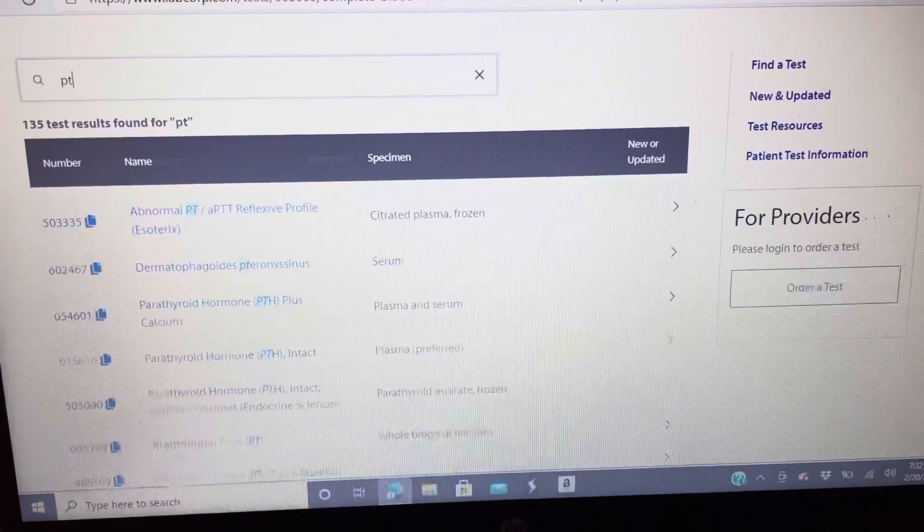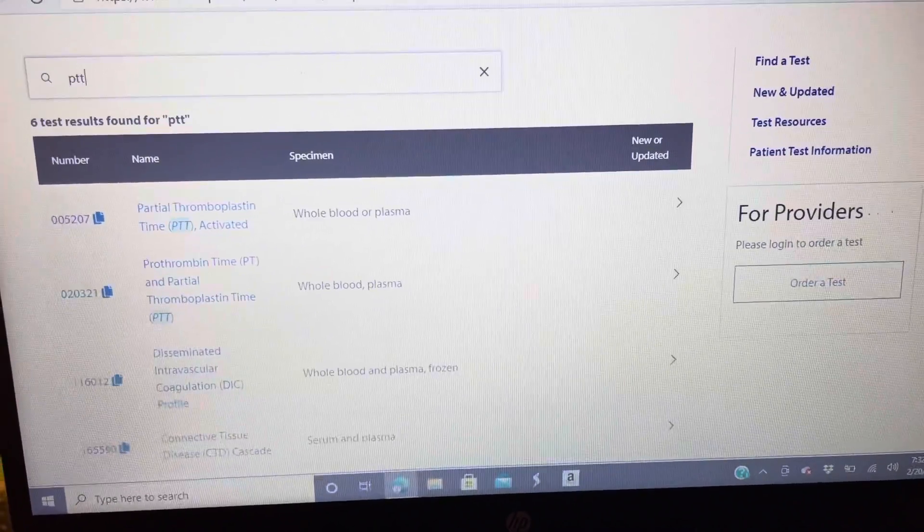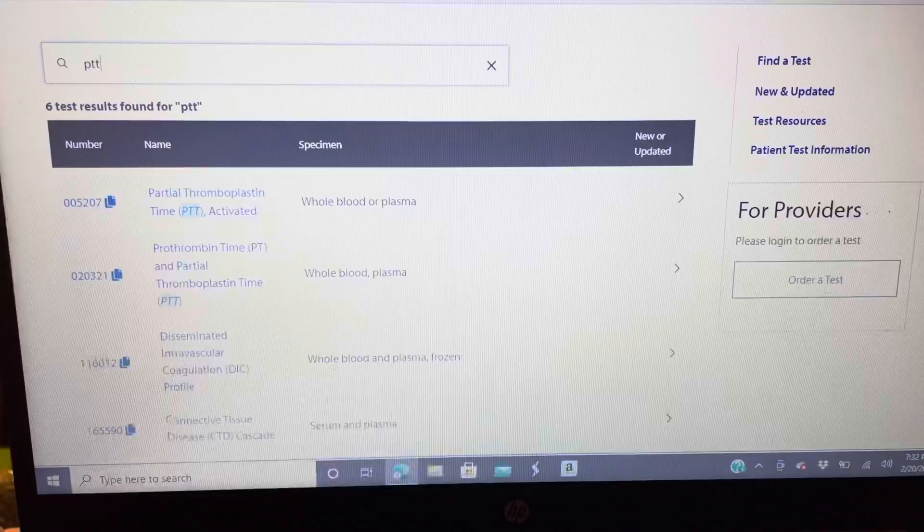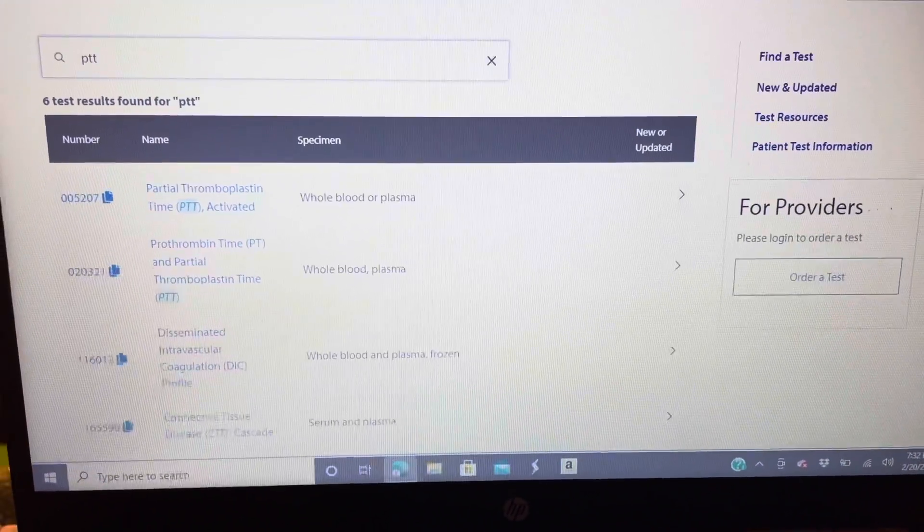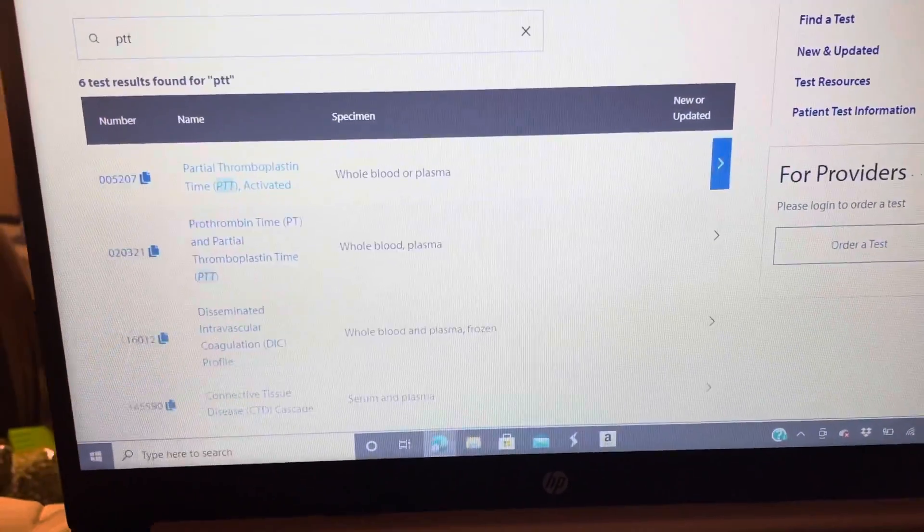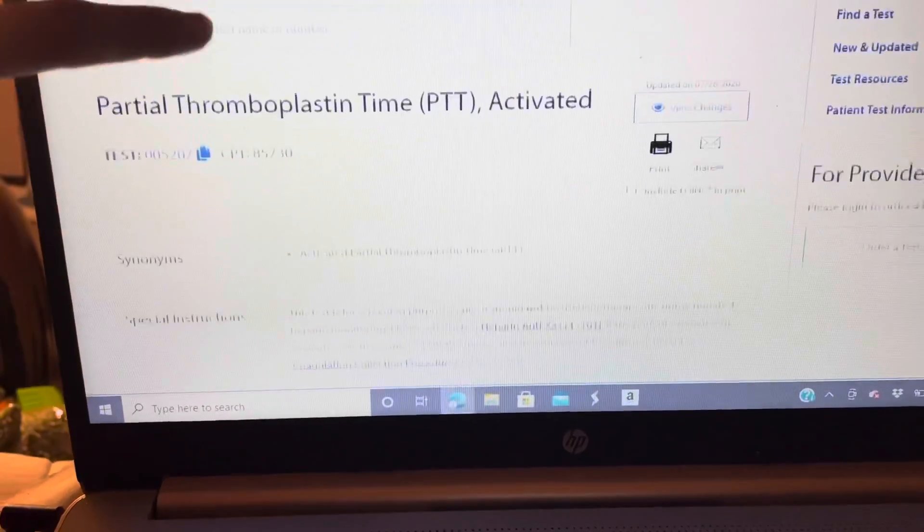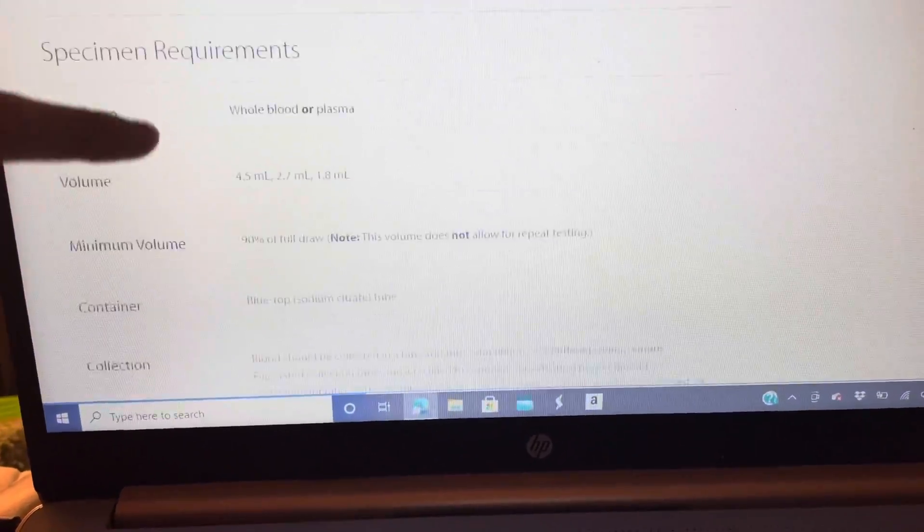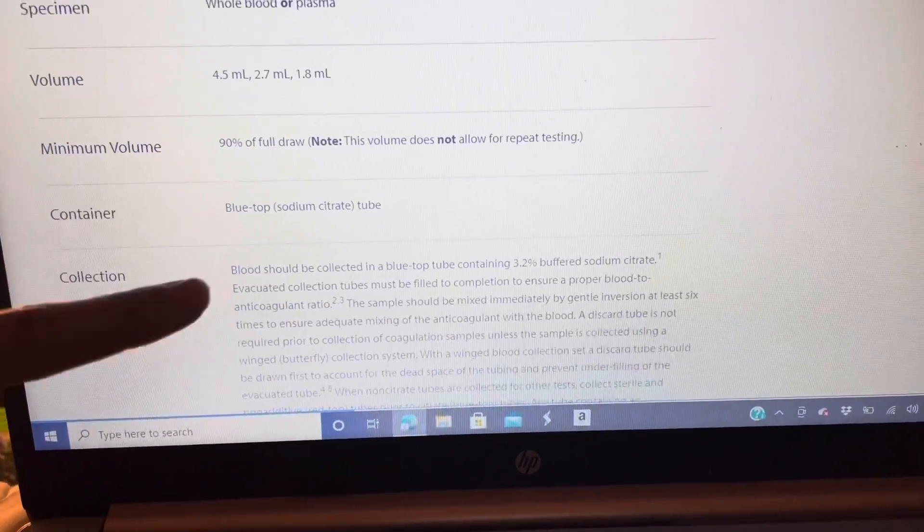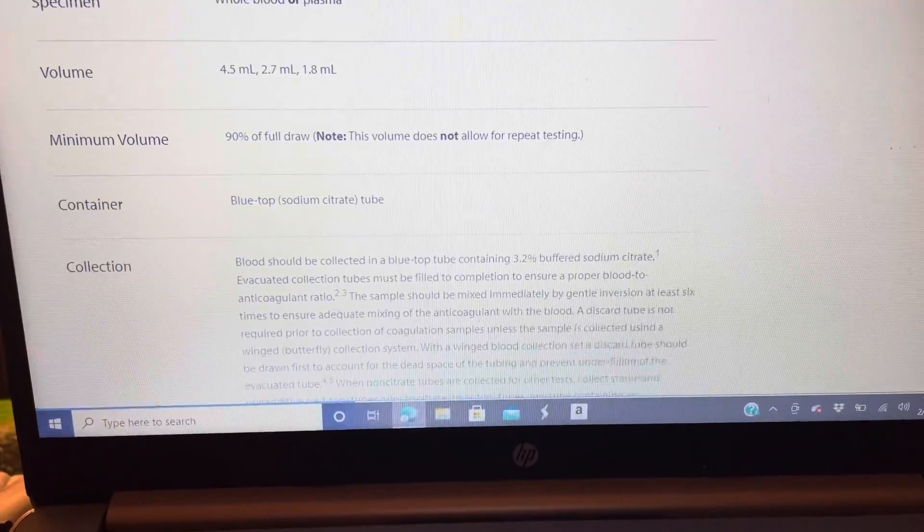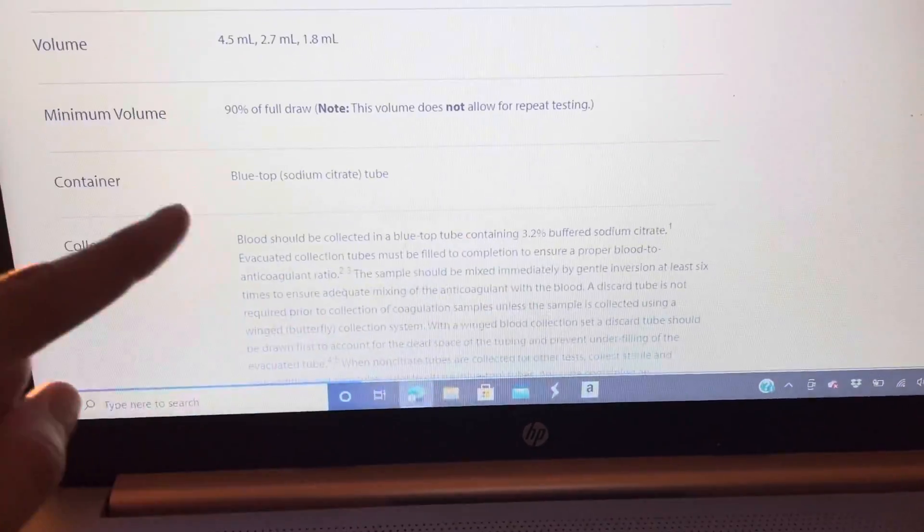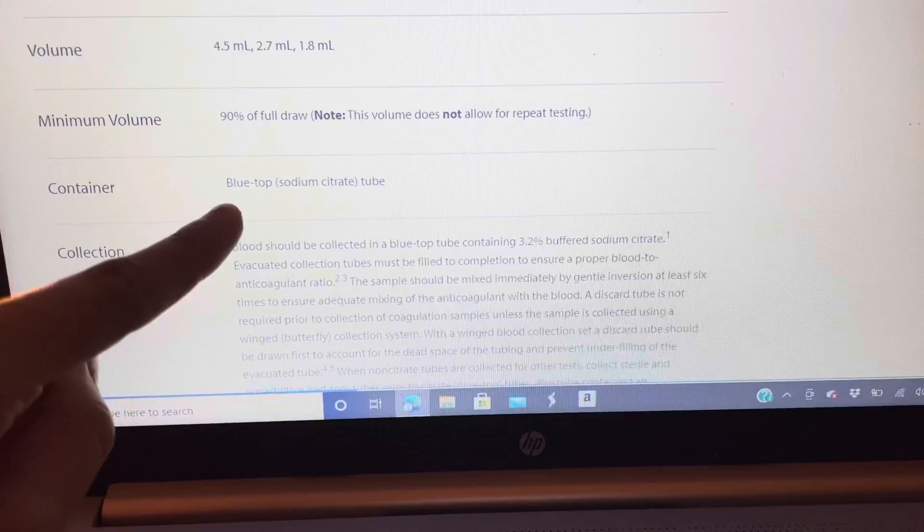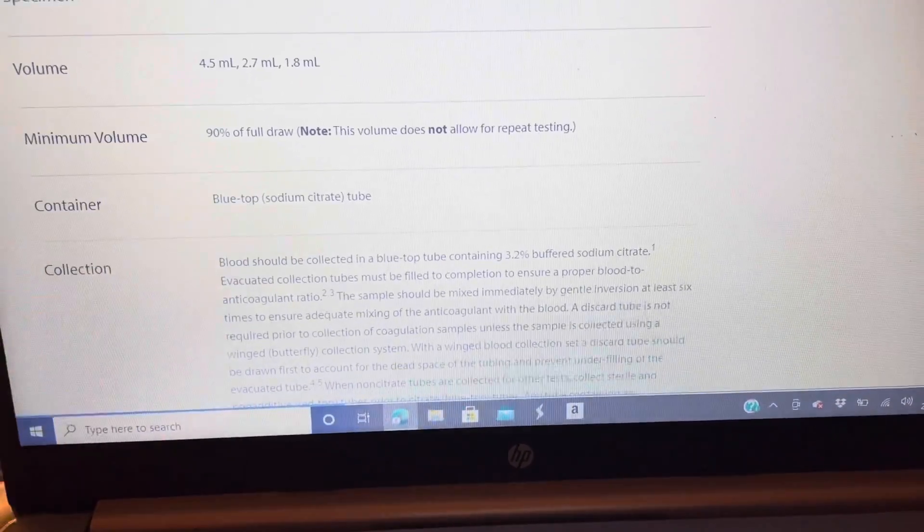PTT. So I just typed in PTT. We're going to scroll down to specimen requirements, container. Container: blue top. It didn't say or you can use this or this, no. Specifically, you can only use for a PTT test a blue top tube. All right.